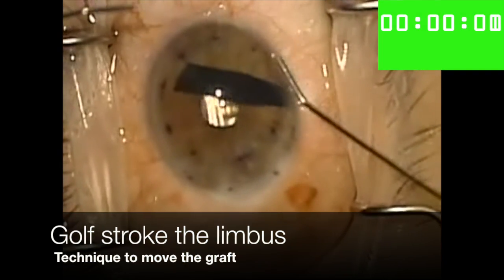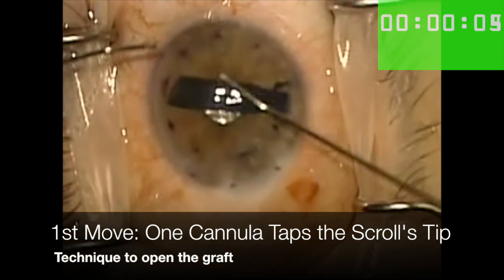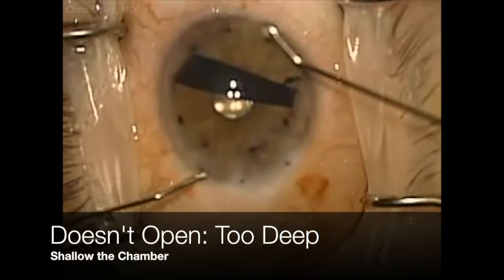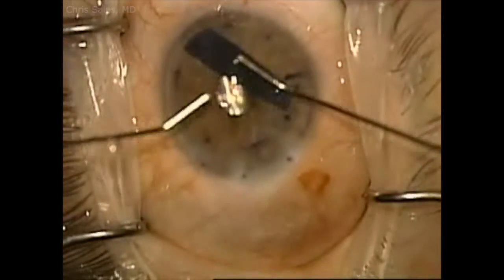Let's watch the video again in real time. I start with a few quick golf strokes to the limbus to center up the scroll and then try tapping out the scroll at one of the scroll's ends. I use a nudging maneuver to get the scroll back into the center of the chamber and then I shallow the chamber some more.